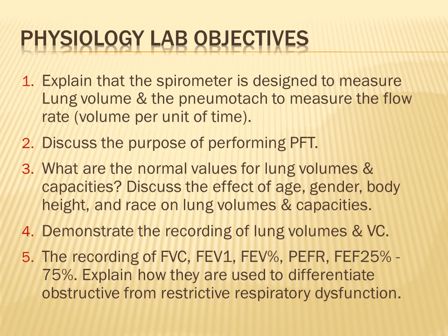And lastly, we will try to understand from this session how we are going to apply some significant values like the forced vital capacity, the forced expiratory volume in the first second, the percentage of the forced expiratory volume to the forced vital capacity, the peak expiratory flow rate, and the flow rate between, or the average between, 25 and 75%.